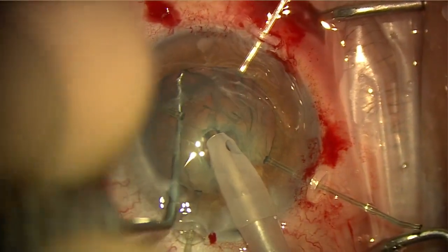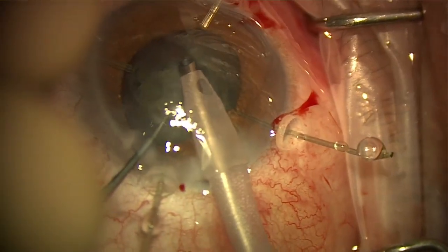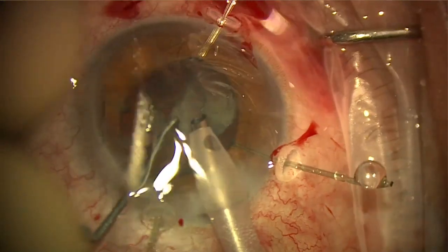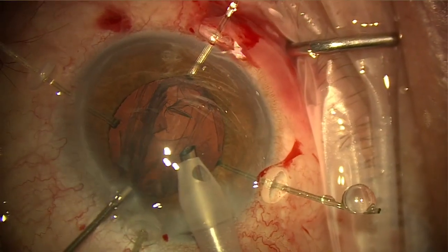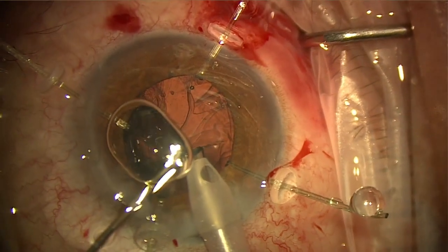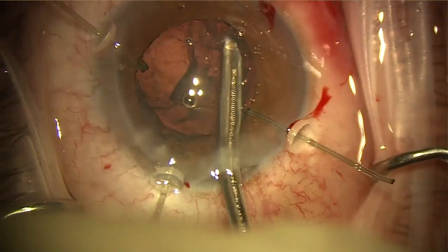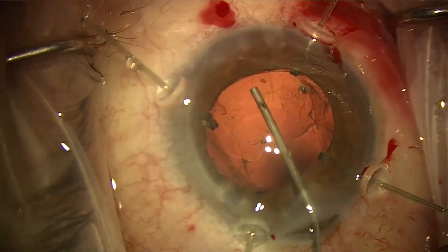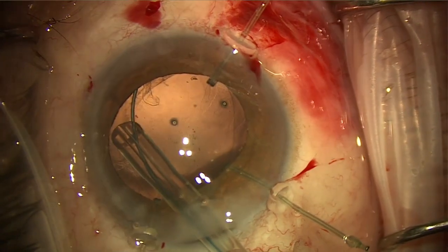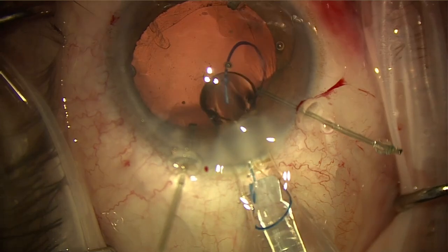The lens is bisected using a chop technique, and then efficiently removed without any significant complications. But you can see here that the bag is rather lax. We probably have about 4 clock hours of zonular loss here. The cortex is removed using a Simcoe cannula, and then we inflate the capsular bag and place a capsular tension ring while leaving in the hooks to stabilize the capsule.